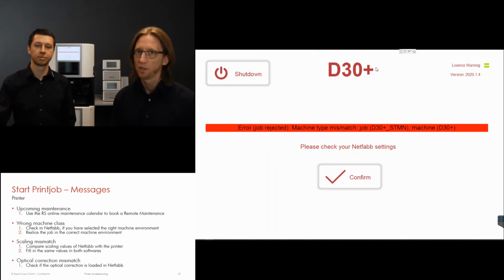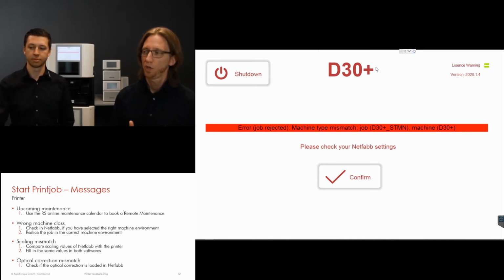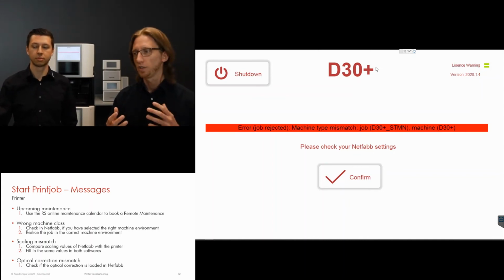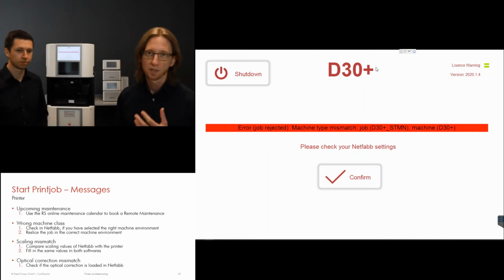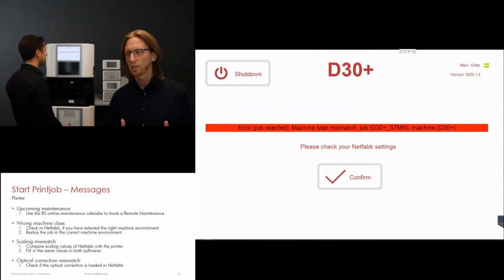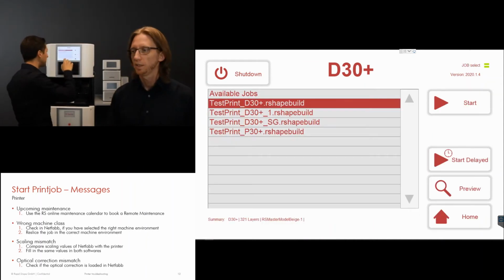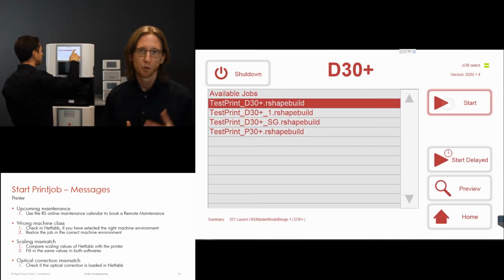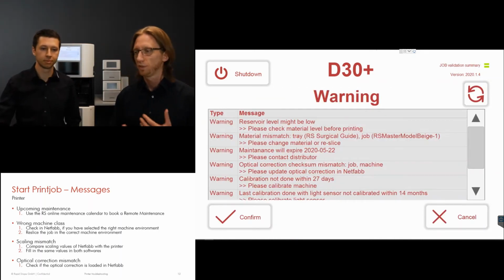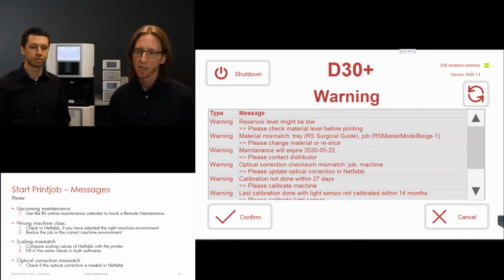And as we can see in the job information, the customer has selected a P30+. So the machine is comparing the information between the job information and what is stored on the machine. If this information is not correct, then we get this error message, and we cannot start this job. I think this is pretty obvious, and it happens quite a lot, especially in the first days when the customer is just using the machine for the first print jobs and is not yet aware of things. He has a learning curve. So that might happen quite sometimes.